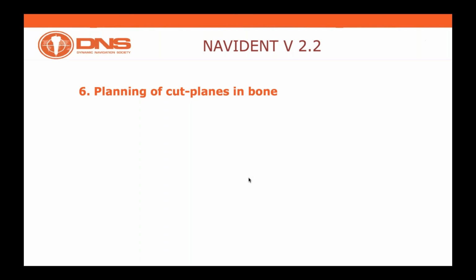And then we will dwell on item number 7, which introduces, I would say, revolutionary and amazing, in terms of simplicity, protocols for treating total edentulous patients, as opposed to using a mini implant, which has been the standard for total edentulous patients up to now.